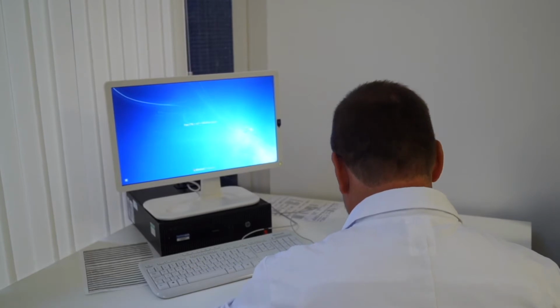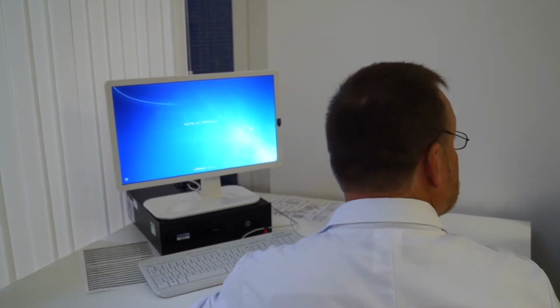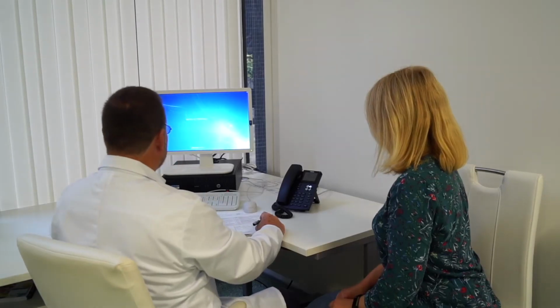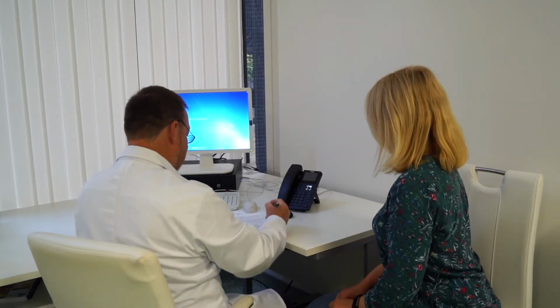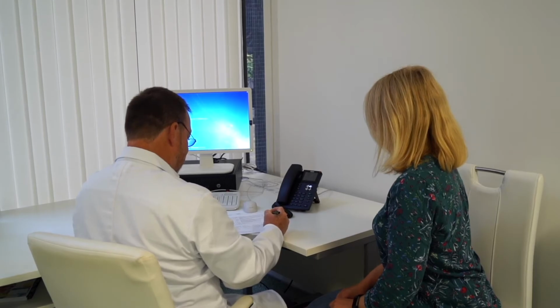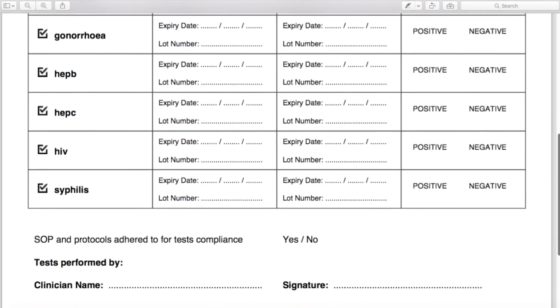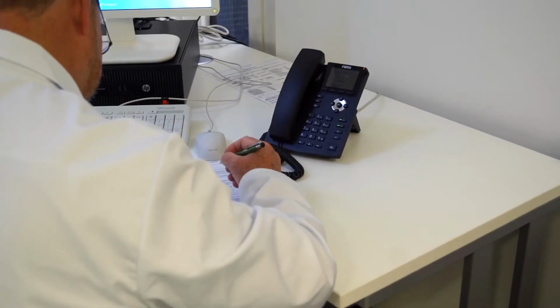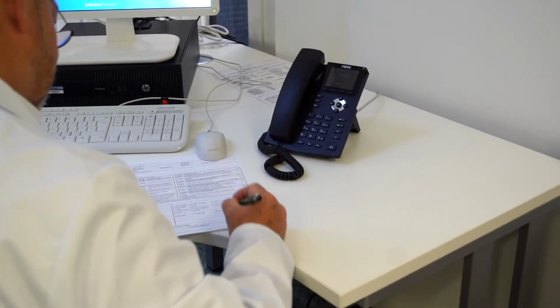Results must then be told to the patient. This should be done verbally in a calm and prompt manner. The patient should be reminded that they may contact Better2Know if they need any further assistance. The Better2Know Instant Test Results Report, which is attached to the patient's booking confirmation email, should be completed. A copy should be handed to the patient.